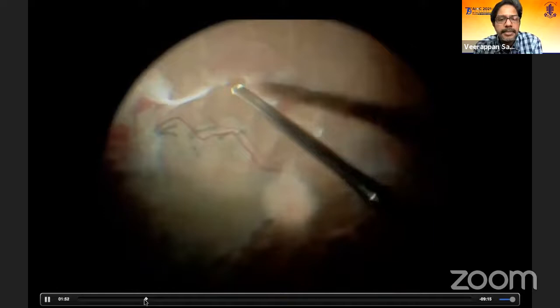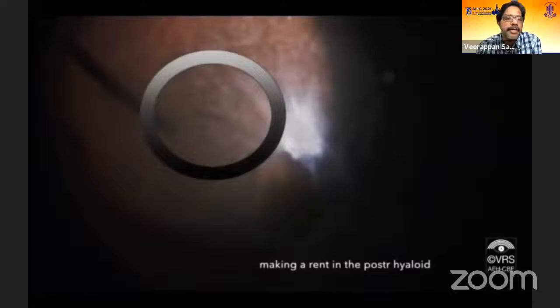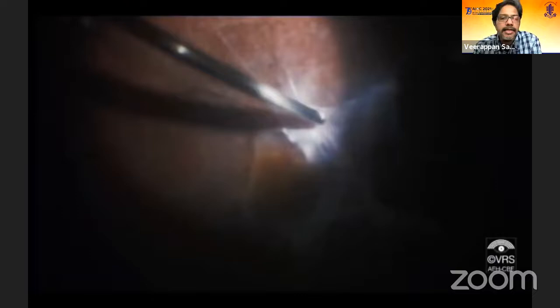For more complicated cases, you must make a mental plan. I am right-handed, so I choose to start from the superior temporal quadrant in the right eye and the superior nasal quadrant in the left eye, because that's how my hand is oriented. Going from top to bottom is much more convenient because your instruments are oriented that way.